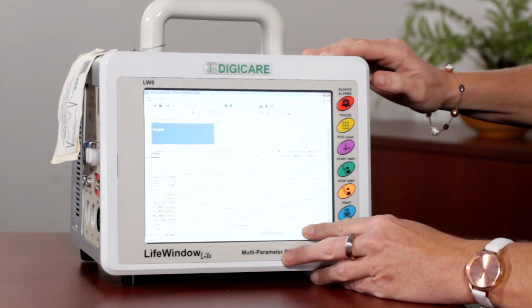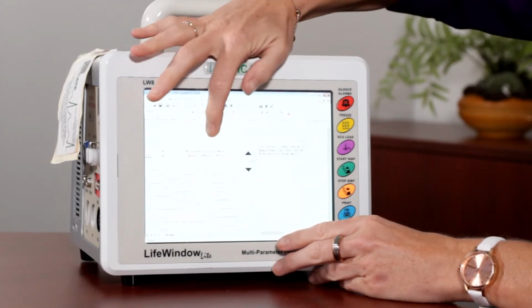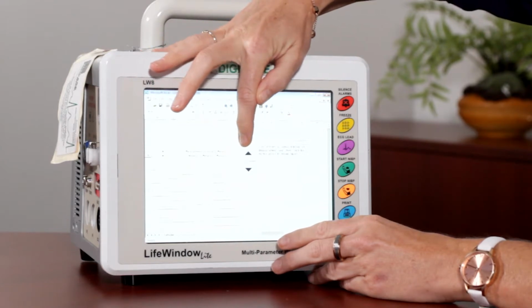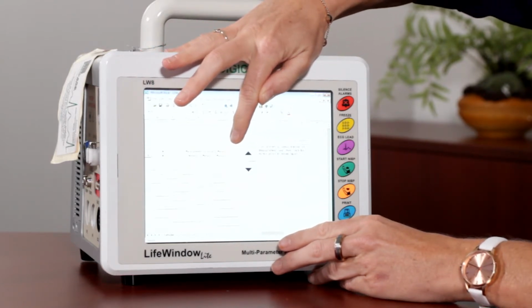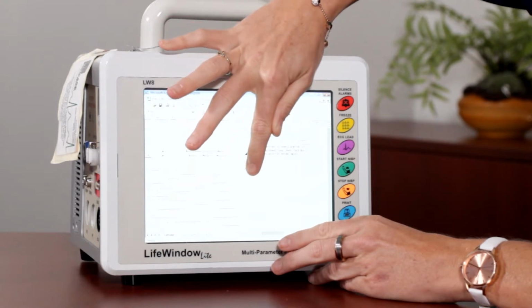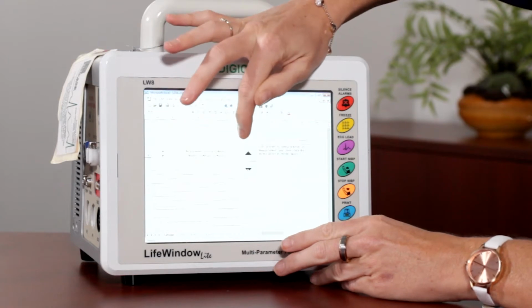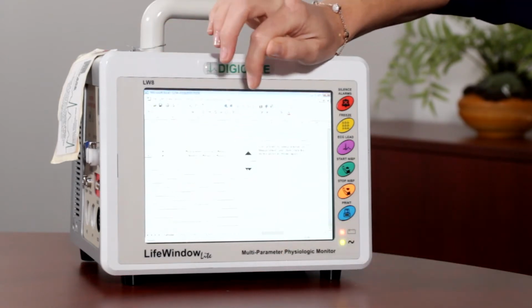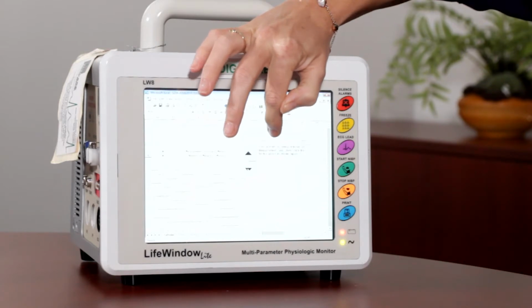It automatically defaults to save every 5 minutes, but you can change that interval of time by actually scrolling over. And here it says measurement interval in minutes is 5. If you wanted to change that, say you did have an event that you wanted to see, you could decrease this time by hitting the black arrows. So say you wanted to do every 1 minute, and then you'd hit click here to renew interval of measurement.